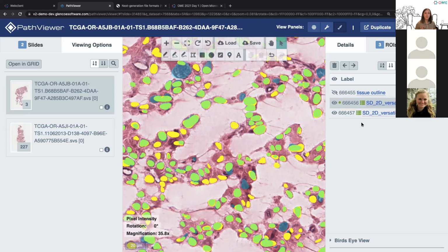I'm now going to hop into talking about how to change the visualization of these objects based on some measurements that you've taken of those objects. Any remaining questions on the OME-Zarr structure itself, what these label images are, anything like that?